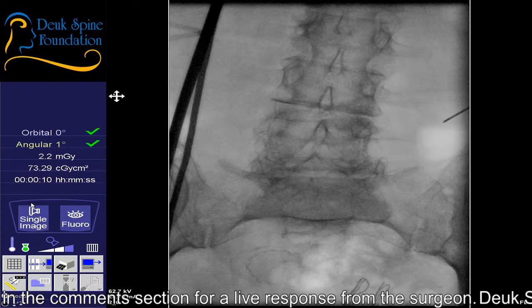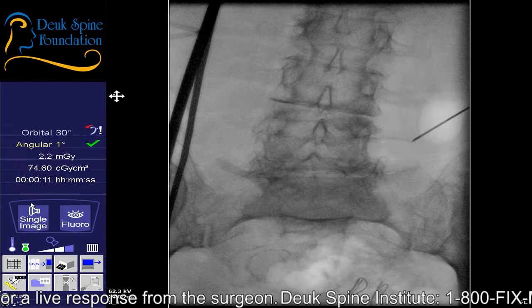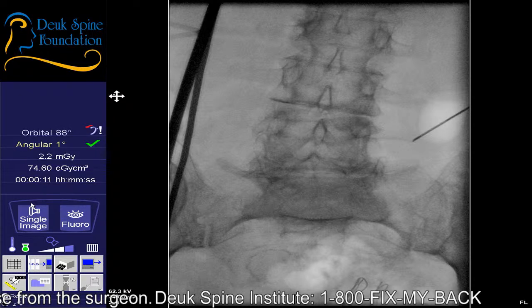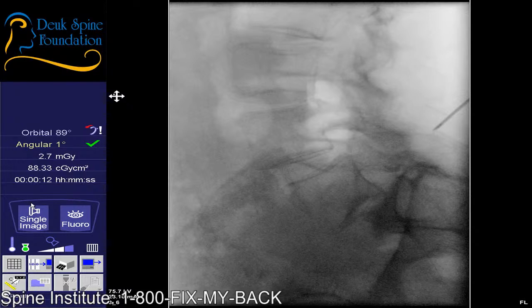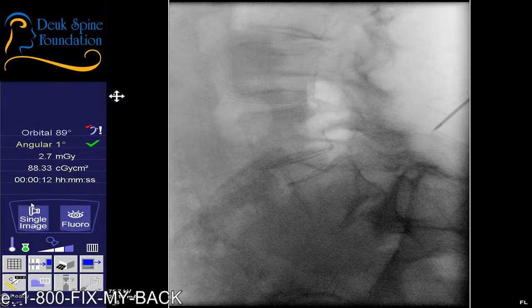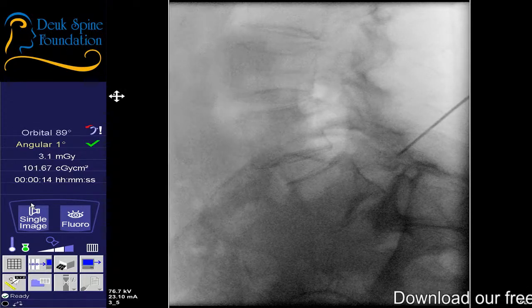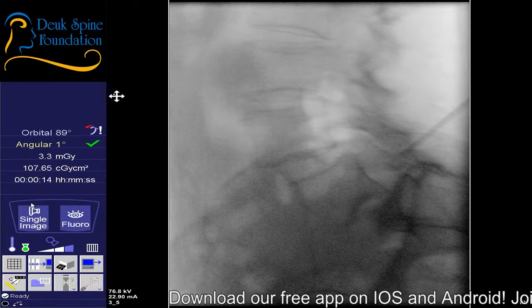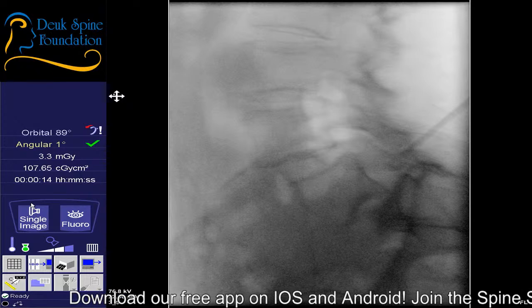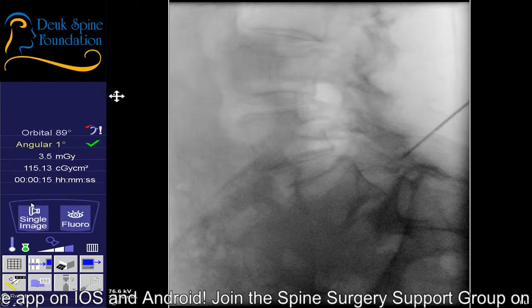You can see the scoliosis of the spine. You'll feel a little discomfort — that's normal. You're doing great, by the way. I think we're close.